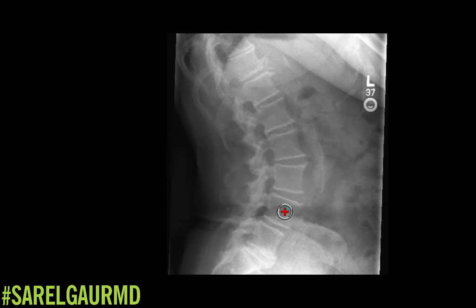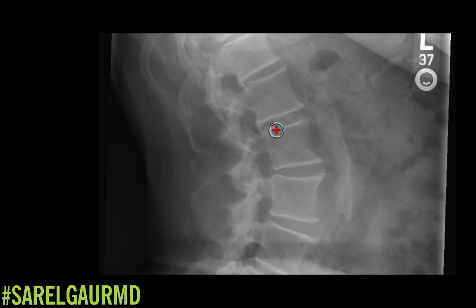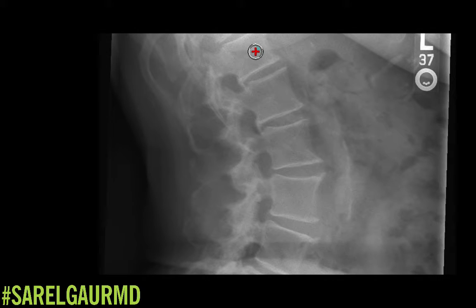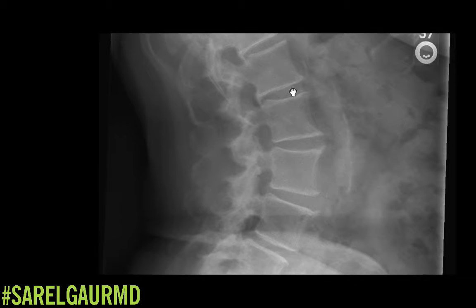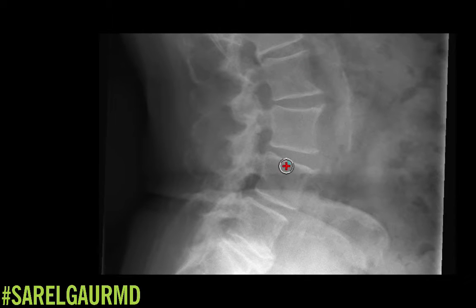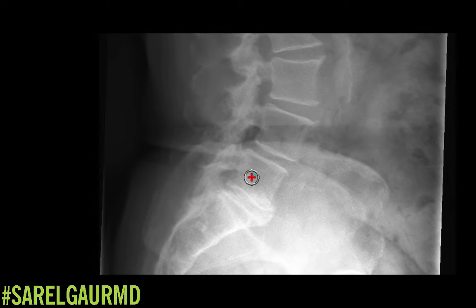Here I'm looking at the lateral view. First thing I'm going to do is find my T12 level. I can see a rib here, so following that back, here's T12. Then I have L1, L2, L3, L4, L5 — so here's the L5-S1 level.